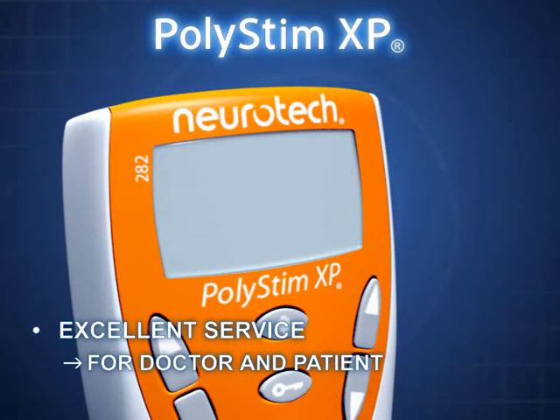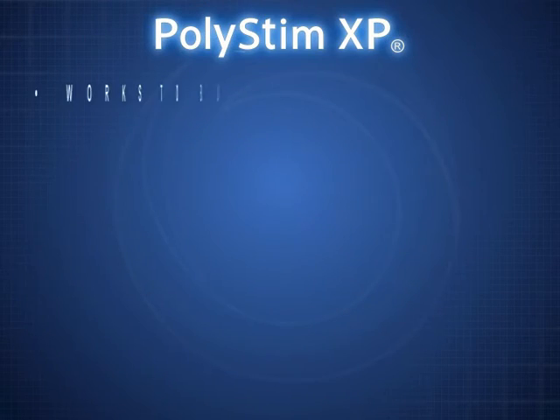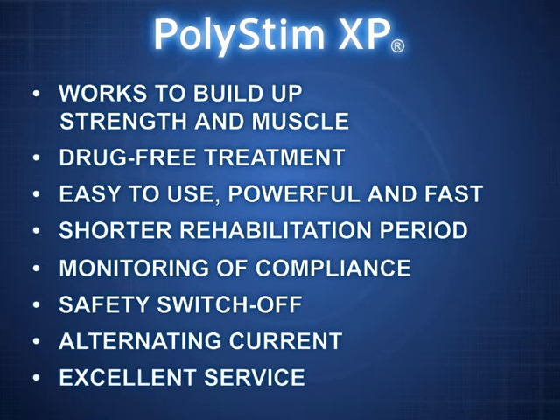Polystim XP is a high-quality, safety-tested product from Neurotech with lots of advantages. It's a highly effective way to strengthen and rebuild weak or atrophied muscle tissue. It's drug-free, easy to use, powerful and fast. It helps reduce rehabilitation times. It has a built-in patient-use compliance monitor. It's safe for patients and uses alternating current.